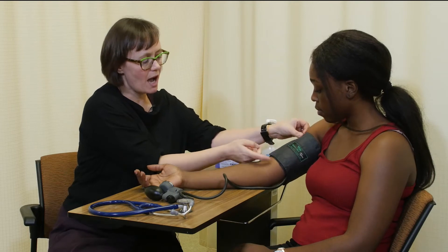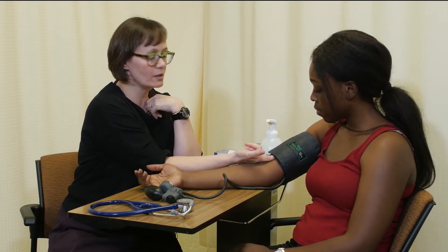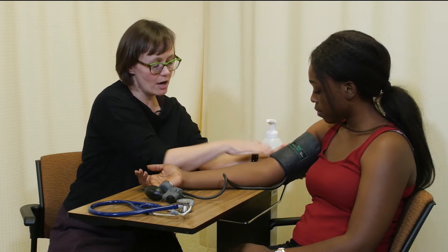I've applied the cuff so that it fits fairly snugly. I can put one finger inside so that the cuff won't move around. It's also straight and aligned on her arm.